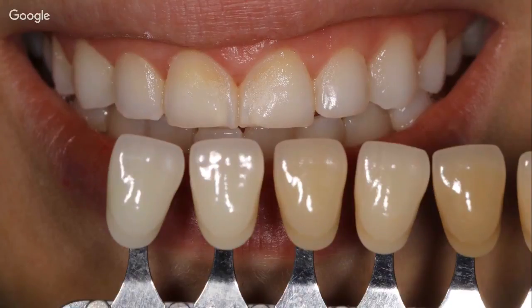In this picture, you can very clearly see the effect of the erosion and the dentine which is present and exposed, and the way it's softening, which could indicate a really quick progression of the disease and the need for a quick intervention.